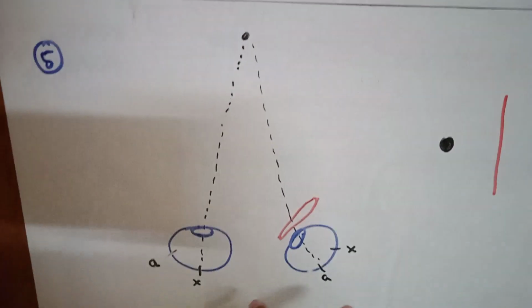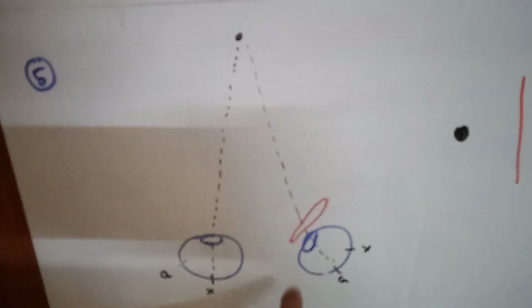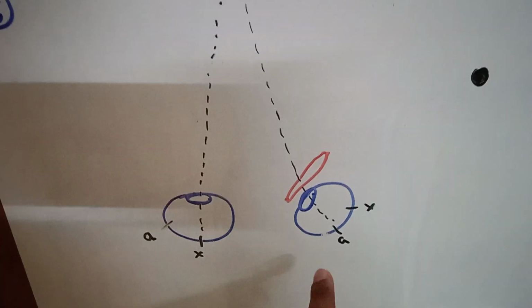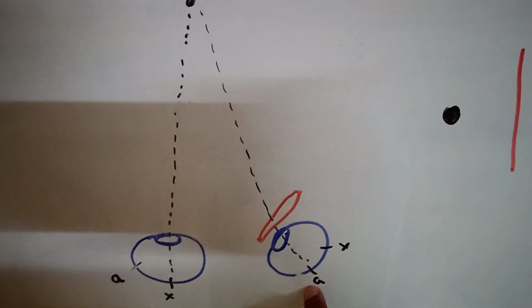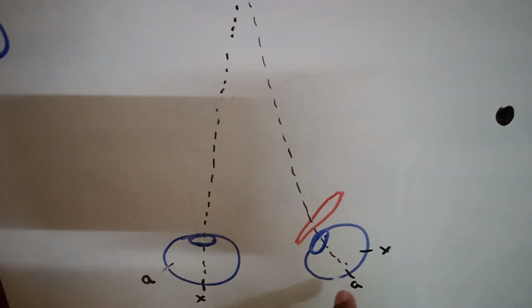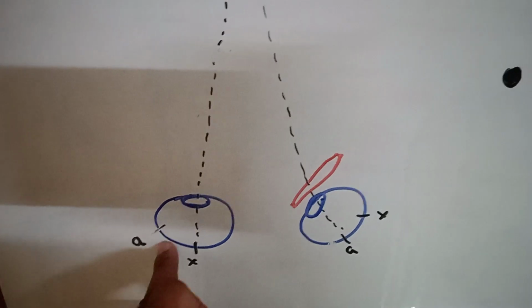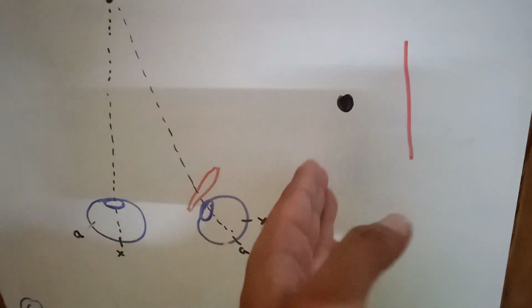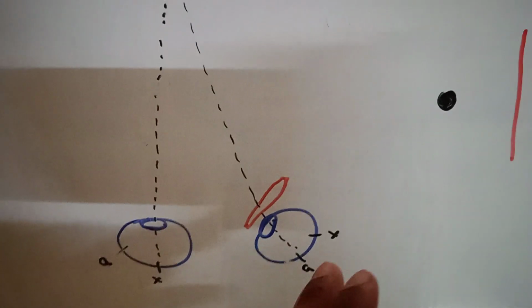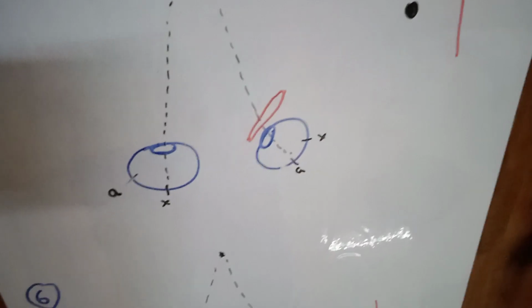So let's say we have esophoria, right? Esophoria. Now where have we placed the rod? On the right eye. Now since this is turned in, the points will change such, and now the rod that was supposed to fall here will fall on A, and A is supposed to bring images from the right side, right? So you will see the rod to the right of the dot. In esophoria the rod will move to the right side. You can try doing this practice at home.